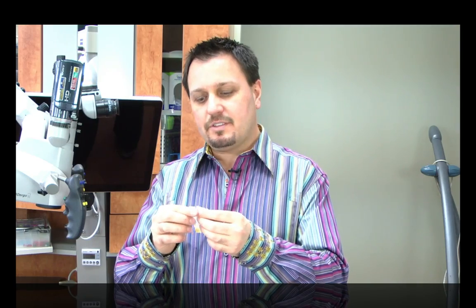Tip number four: when you're taking the bite record, make sure you have enough leaves so that when they go back and squeeze and you look at their molars, there's about one and a half to two millimeters of occlusal clearance. You need that space for the bite record; otherwise the bite record is too thin and when you go to trim it, it's going to fall apart. Roughly one and a half to two millimeters is the optimal range — I wouldn't recommend much more than that.